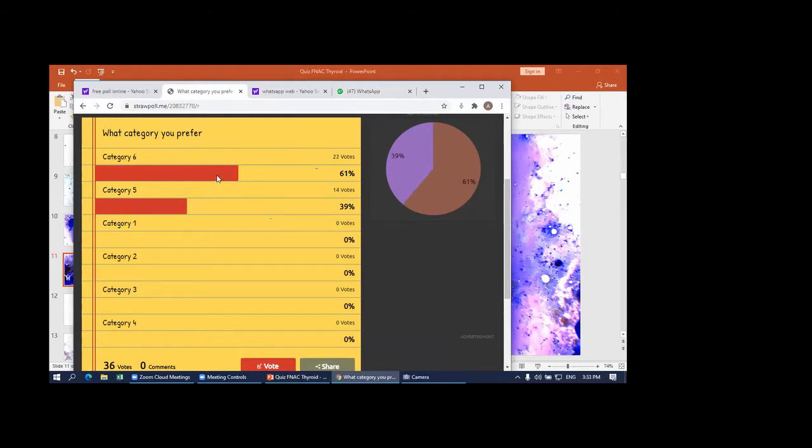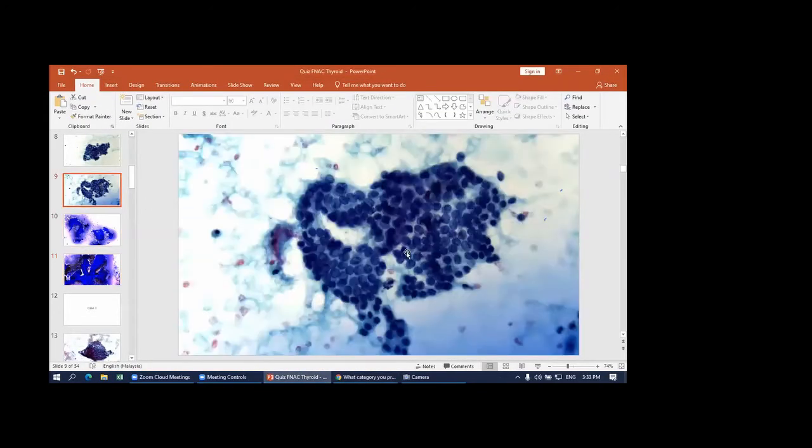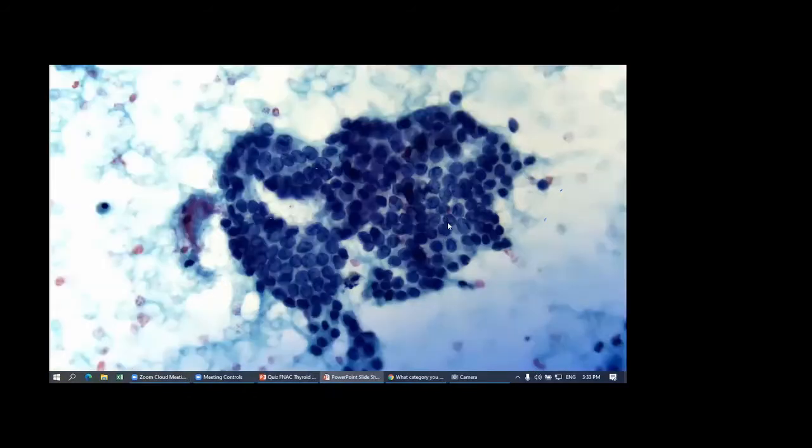And with the follow up, histo is actually PTC. Okay. Rizal, were there any intranuclear inclusions? Because I couldn't make them out just now. There was grooving, but the thing is that this is quite subtle. Can you see that one there? There's some groove there. I can see the grooving, but I was wondering if there were any inclusions. There's an inclusion there, but there's not many. There's one there. Oh, where? Like that. Oh, that. Okay, I can see it now.